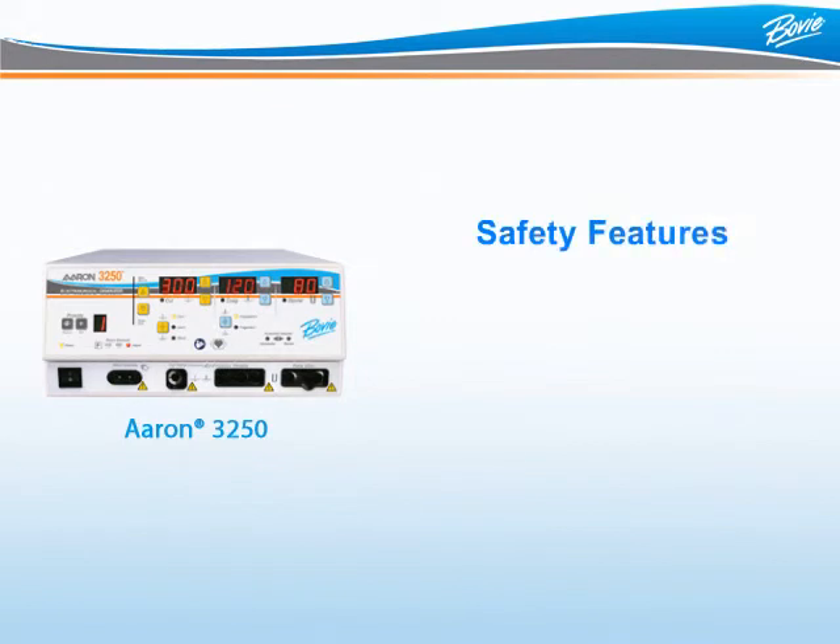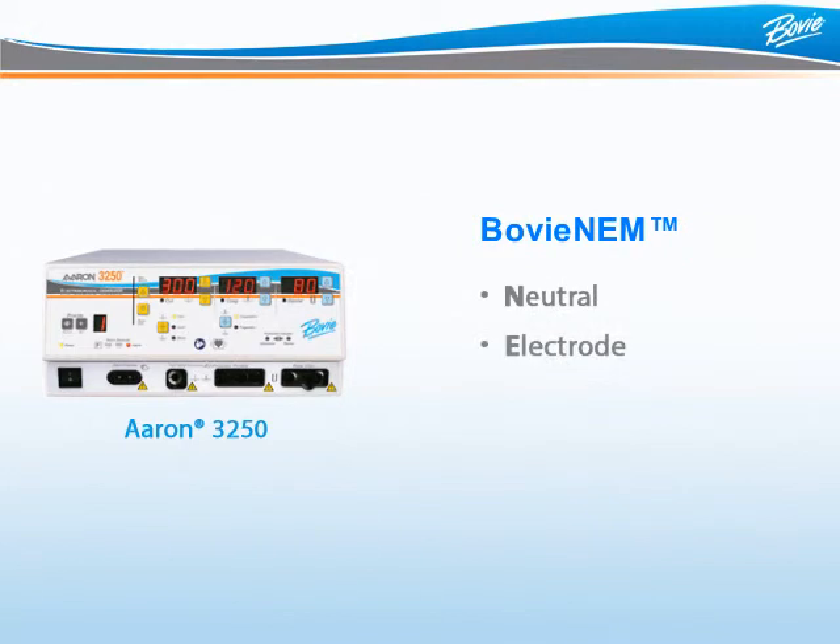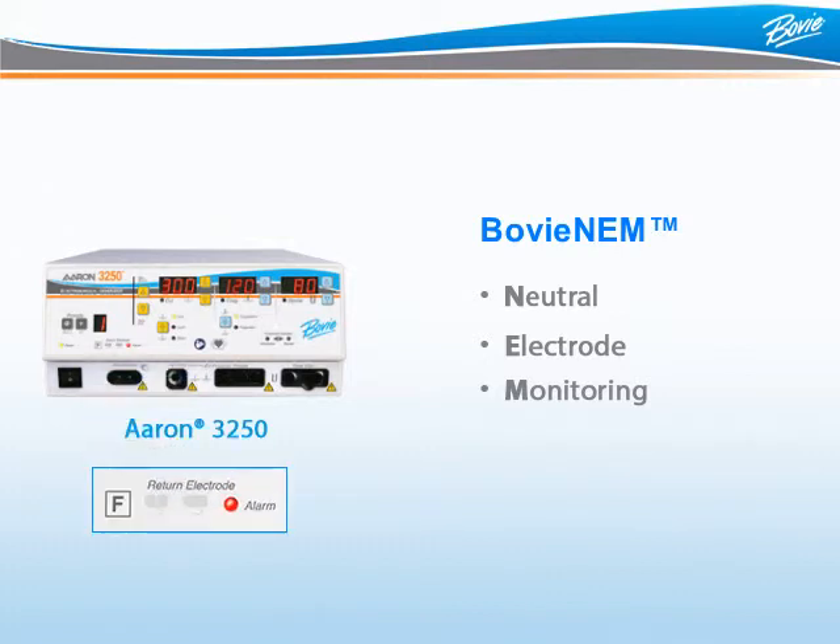Electrosurgery safety is a combination of good equipment design and safe surgical practices by a well-trained and vigilant staff. With the ARIN3250, safety is built inside the unit with features including Bovee NEM, Bovee DED, and Bovee FCFS. Bovee NEM, or Neutral Electrode Monitoring, means the generator is consistently checking to ensure the grounding pad is properly connected to the patient when using disposable split pads, reducing the risk of patient burns. If during a procedure there is a loss of contact, the ARIN3250 will alarm and the unit will disable until the grounding pad is properly connected once again. This feature is only available when a disposable split pad is used with the generator.